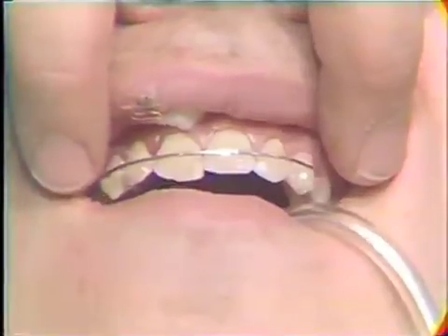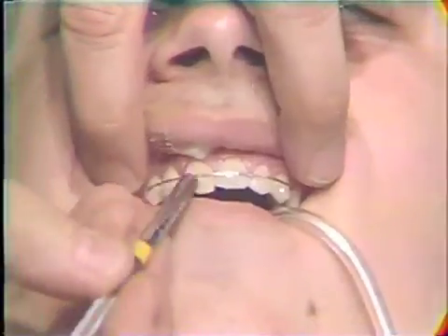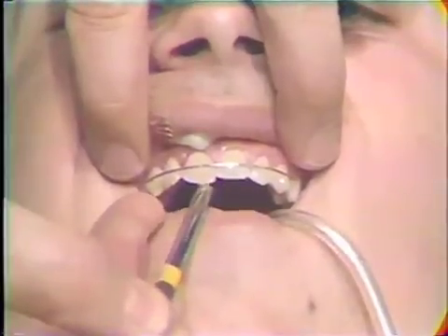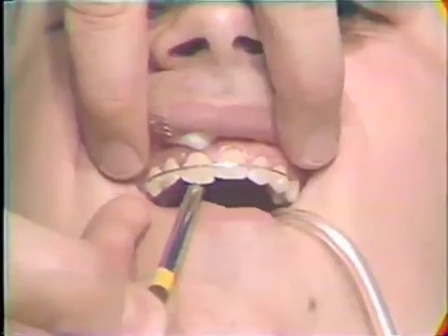Now let's demonstrate the result. Remember the mobility we initially had? The right central and right lateral are now quite stable. We're going to bring Bob back in two weeks and do an electric pulp test to see if these teeth have retained their vitality, and check the splint at that time. Four weeks after that, we'll bring him back again, check vitality, and decide whether to remove the splint. In most cases, splinting can be kept on for about six weeks, which is sufficient—but there's no magic in that time. If necessary, we may keep him splinted for another four to six weeks.